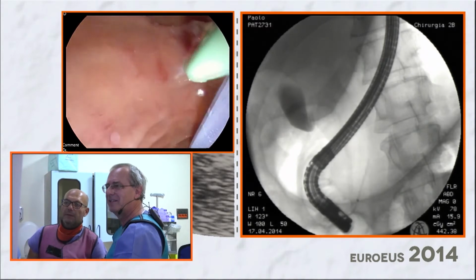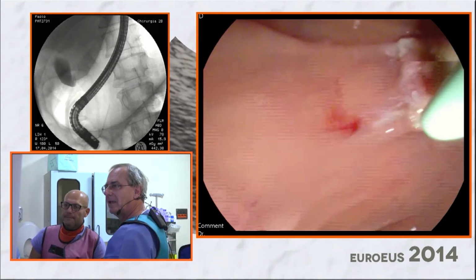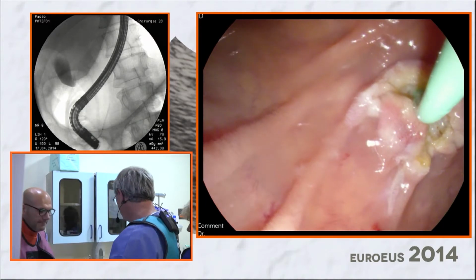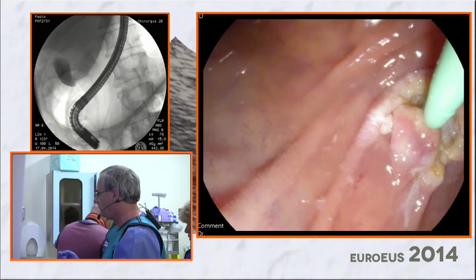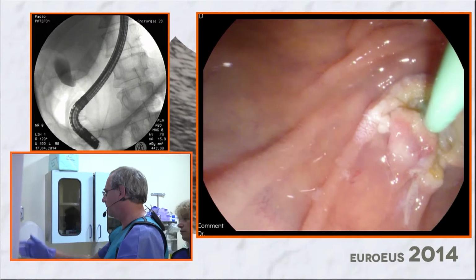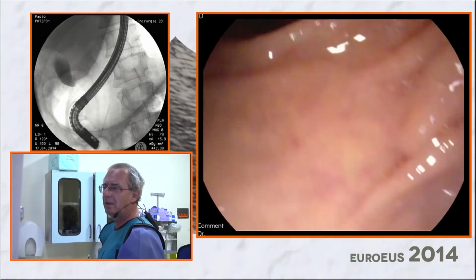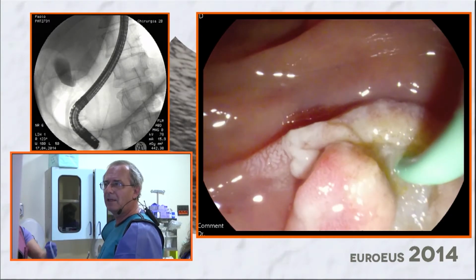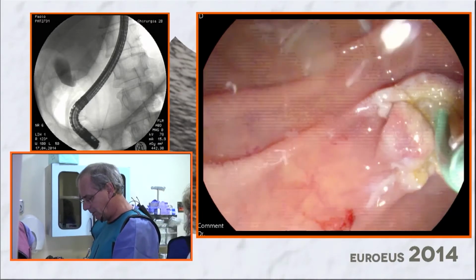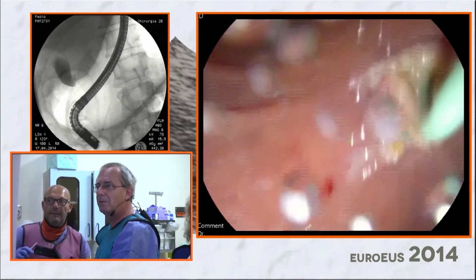No, senza contrasto. I think that the stent is still partly inside the. I need something bigger, pusher, 10 French, something to push out the stent. Because I had this feeling that the stent was still partly in the channel, and now probably it should be out. No, still didn't. Okay, so I go with something bigger just to be on the safe side. I don't want to displace the stent by removing the scope.